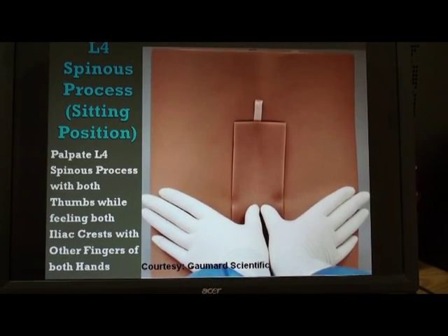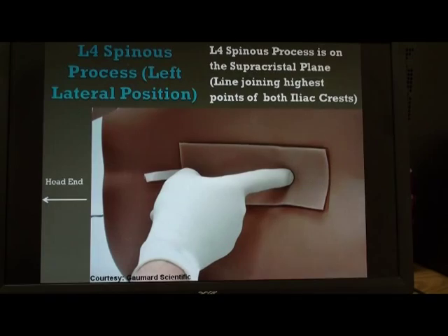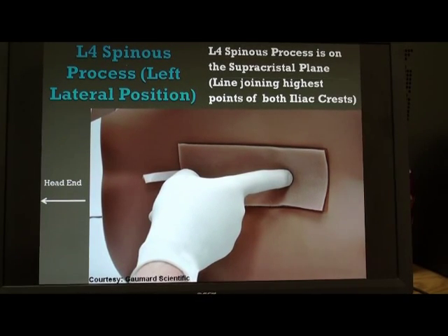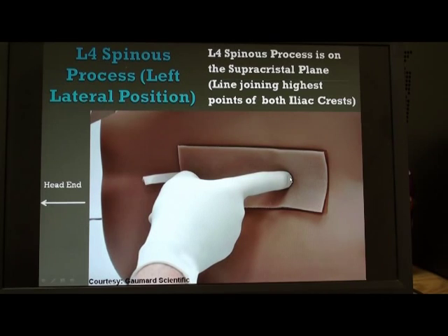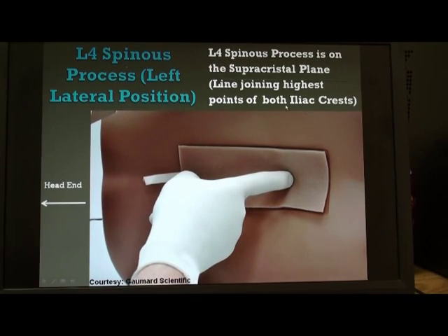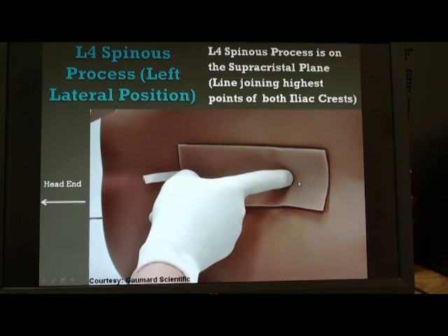For the rest of the video, we are going to demonstrate the lumbar puncture with the patient lying in the left lateral position. The trainer is lying with the head end here and the foot end here, and this is the back of the patient. The index finger is located over the L4 spinous process. We take the highest point of the iliac crest on each side and join them by an imaginary line known as the supracristal plane, and that plane goes through the L4 spinous process.